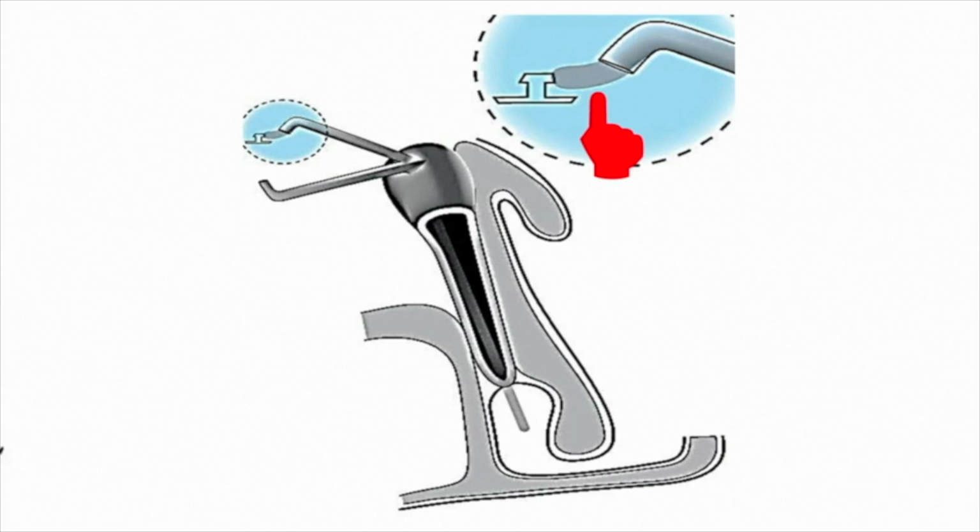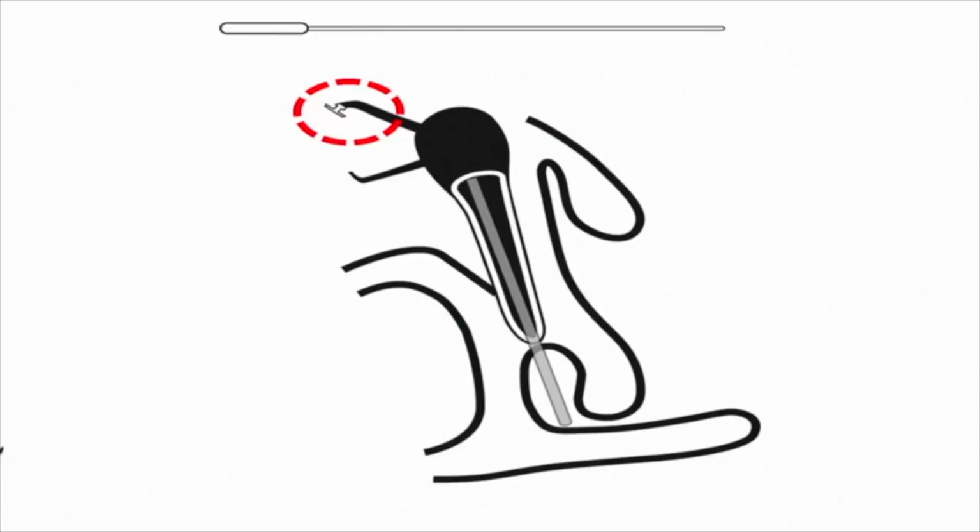Third, if after completely removing the insertion guide, the silicone sleeve can still be seen between the fixation head and the punctum, the MASTERKA may have been incorrectly placed. It should under no circumstances be forced inside the canaliculus. This would squash the silicone like a spring, such that it may be expelled prematurely, therefore leading to a failed procedure. The MASTERKA should then be removed from the tear duct and the insertion guide put back in place in the lumen. After that, the entire nasolacrimal procedure should be repeated.